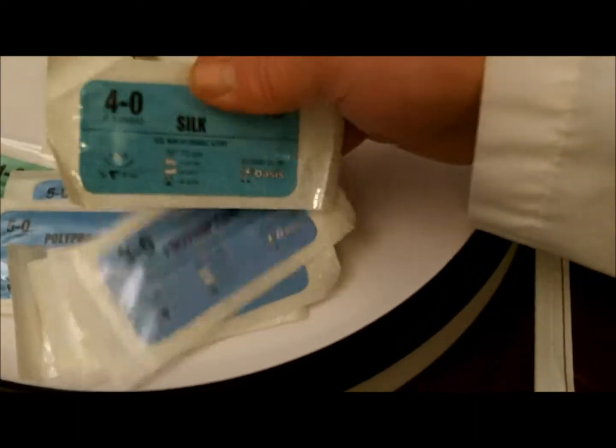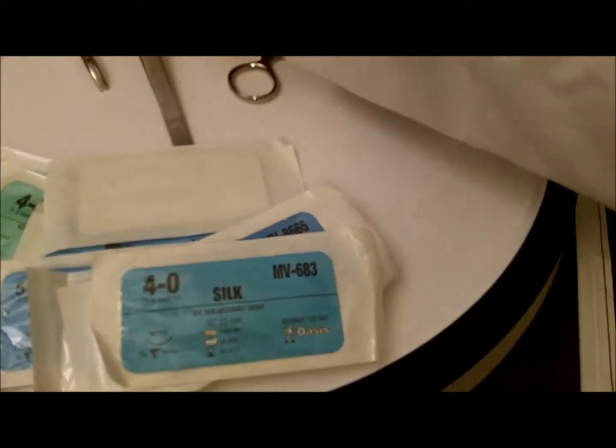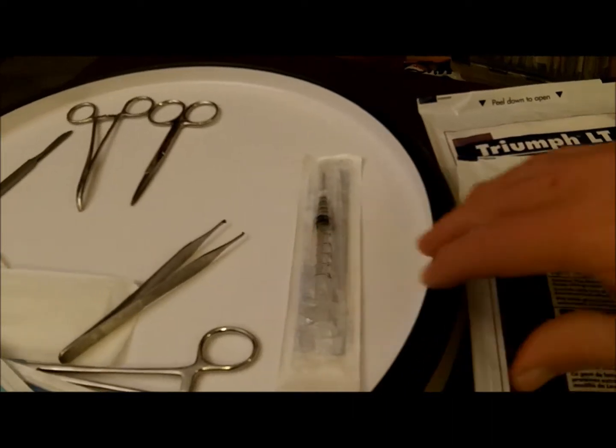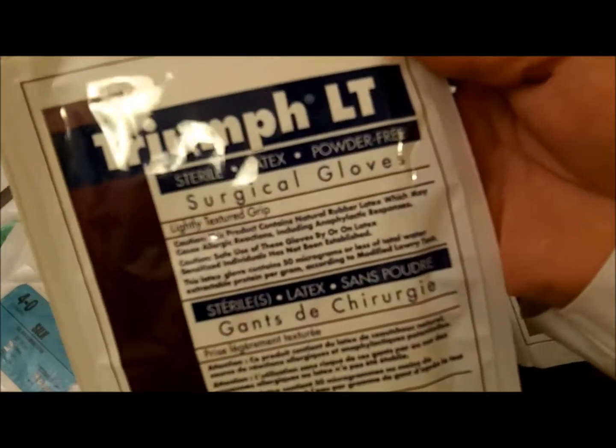We've got a few different instruments we'll be using. On the tray we've got a variety of sutures. I'll be using the 4-0 silk, hoping that's a little easier to tie than the polypropylene — instrument to hold on to the suture and forceps to pull the skin back. Probably not going to use the syringe because the foot's not going to feel any pain. We have surgical gloves and these are great. These are 7½, latex powder free.